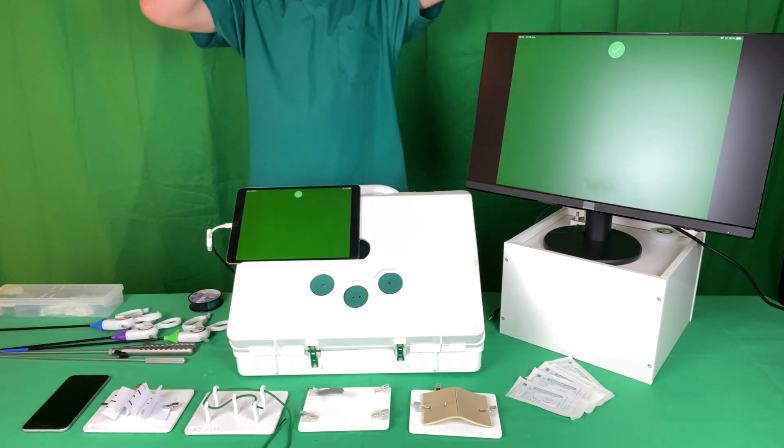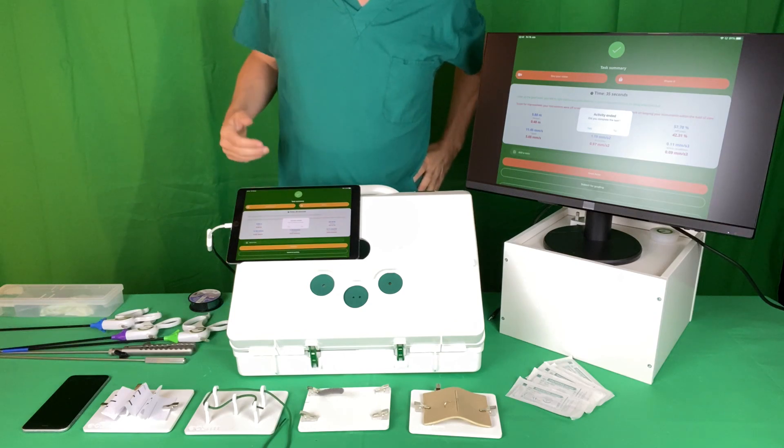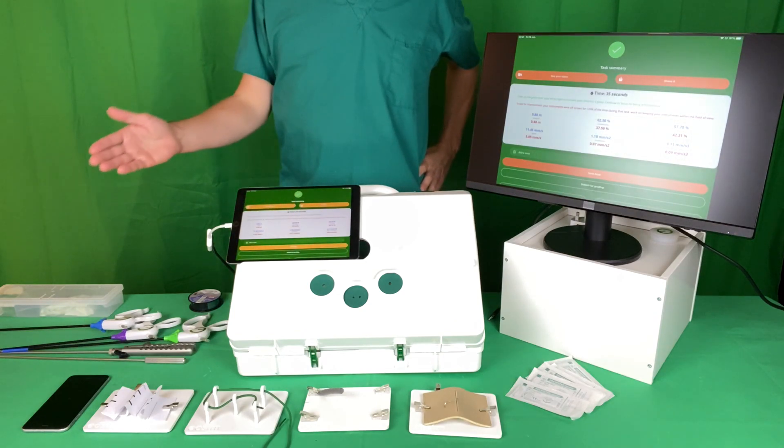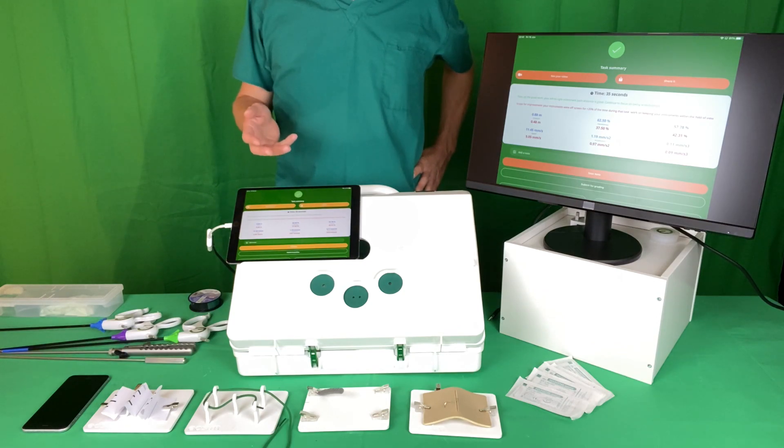While you've been doing this the software has been mapping the movement of your instruments. You get a list of metrics: how far your instruments have moved, how much time the instruments spent on or out of the operative field, how smooth the motion has been, and so forth.